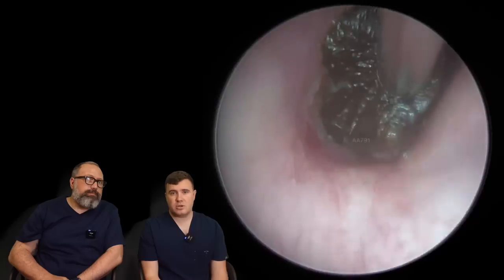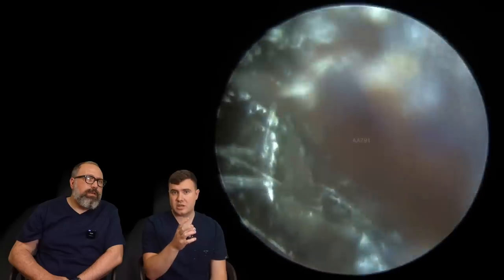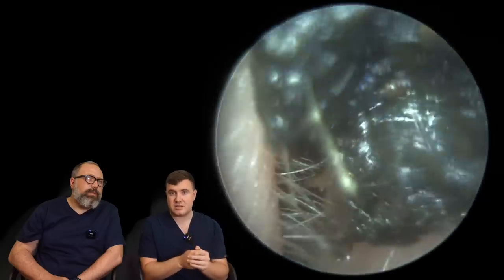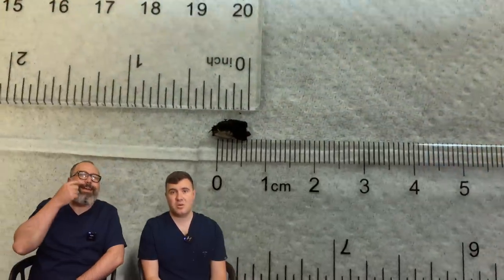What we always try to do is hold the suction onto that plug of wax in a hope that it'll just lift the whole thing out of the anterior recess. We've got a standard size tube here just to get a better grip, even though we're quite far into the ear. I don't want to risk this coming away in little tiny bits. It's always a difficult call — you're holding on and just using the power of the suction to draw it down. Looking nice and healthy — a really impressive plug.